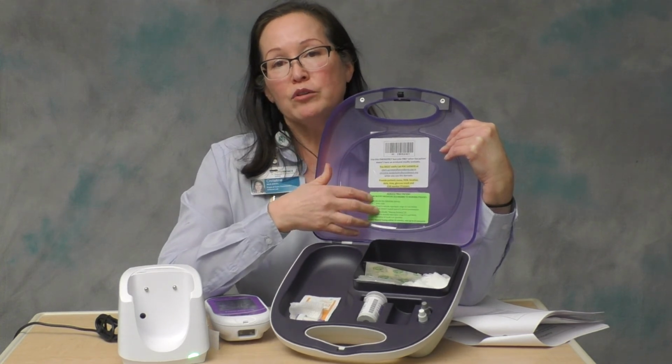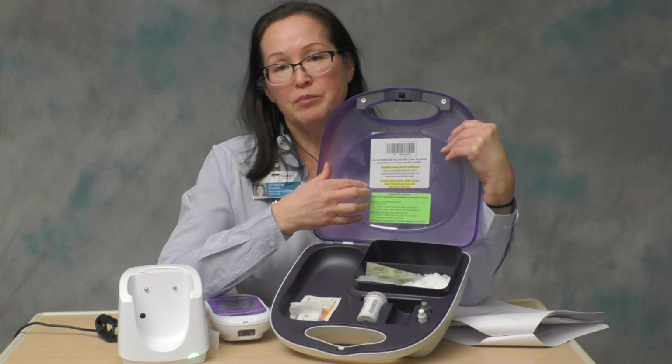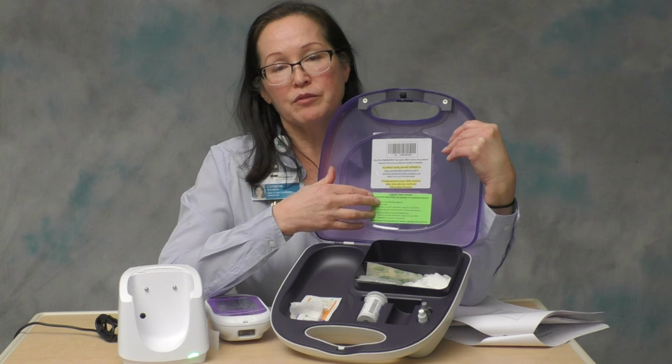But regardless of whether you run the test with the emergency barcode on a patient or non-patient, you must call our office every time.